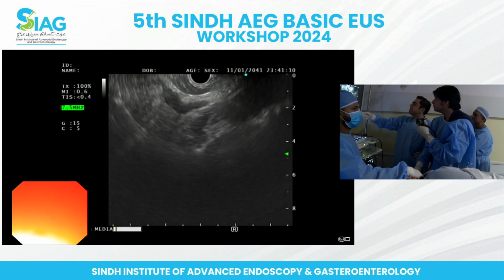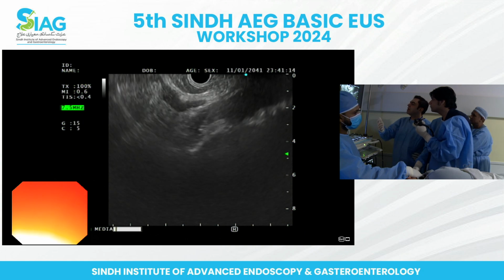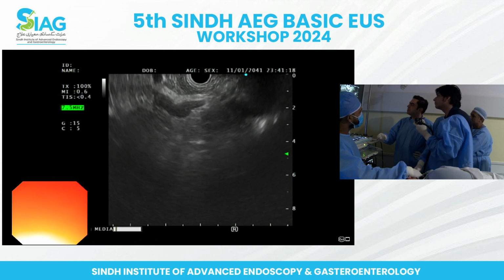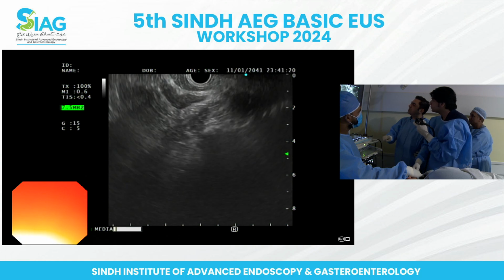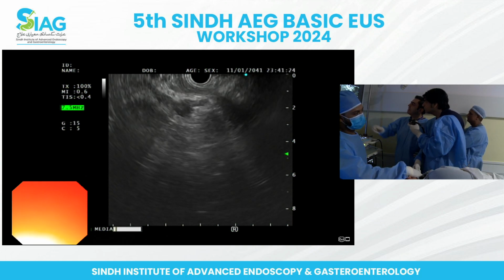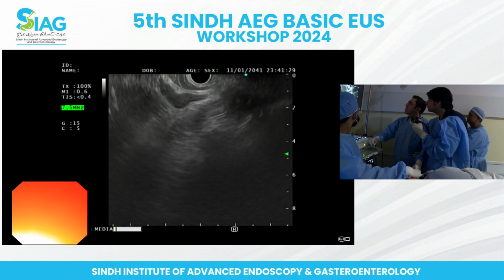If you rotate it left and right, sometimes the celiac axis doesn't come off from the front, anteriorly. It can come off from the sides as well, and therefore it's better to do a dynamic view. You move it left and right until you can see where it is coming from. The SMA just came into view in the bottom. You can see that.